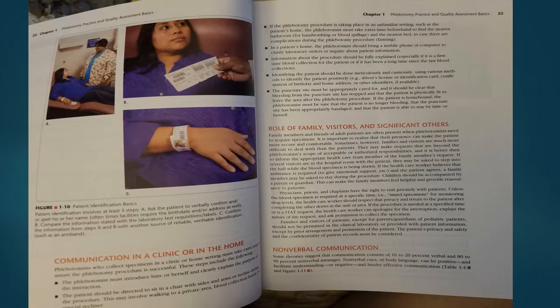Identifying the patient should be done meticulously and cautiously, using various methods to identify the patient positively, such as a driver's license or identification card, confirmation of birthday and home address, or other identifiers if available. The puncture site must be appropriately cared for, and it should be clear that bleeding from the puncture site has stopped and that the patient is physically fit to leave the area after the phlebotomy procedure. If the patient is homebound, the phlebotomist must be sure that the patient is no longer bleeding, that the puncture site has been appropriately bandaged, and that the patient is able to stay by him or herself.